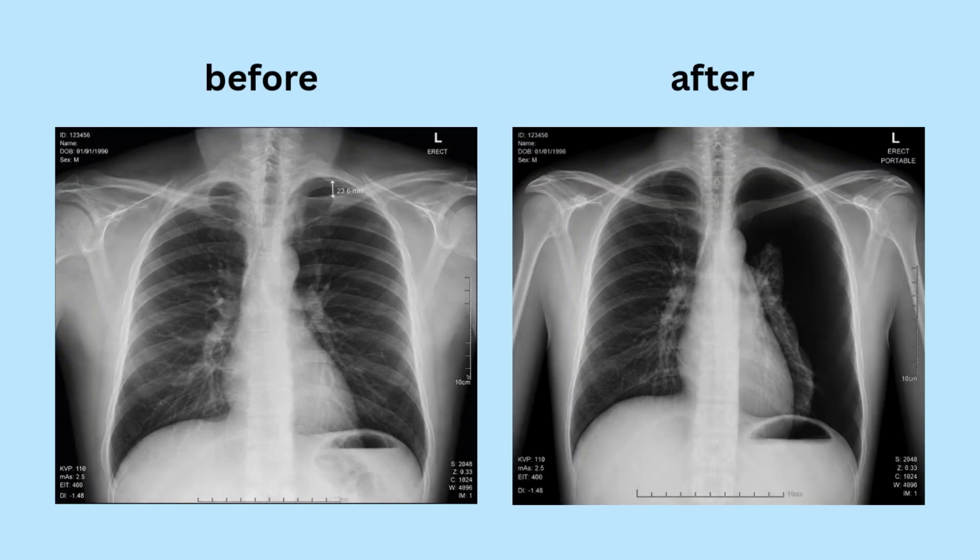The supervising clinician reviewed both radiographs with the resident. On the first image, a subtle left apical visceral pleural line with absent peripheral lung markings was visible, measuring less than 3 centimeters from the apex, consistent with a small left apical pneumothorax. The AI tool had produced a false negative result, but the clinical presentation had been highly compatible with pneumothorax.